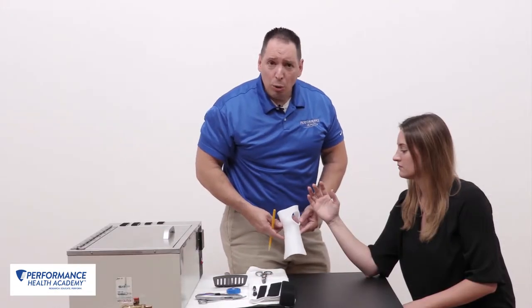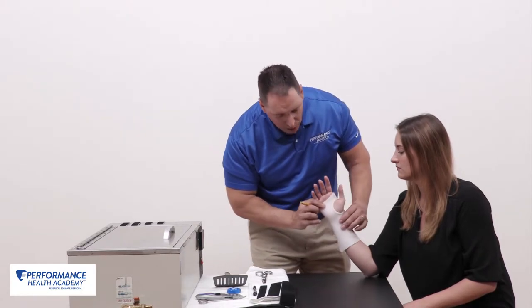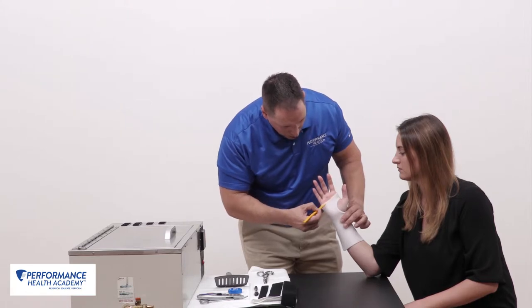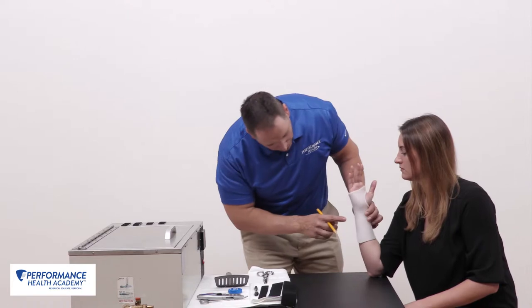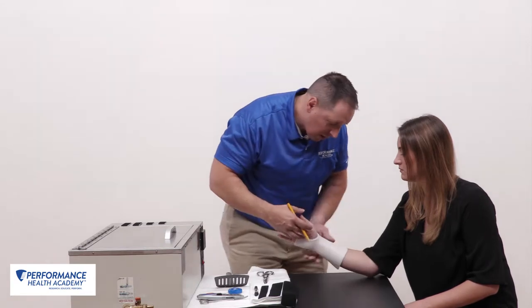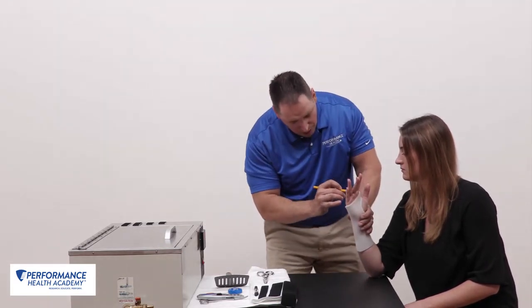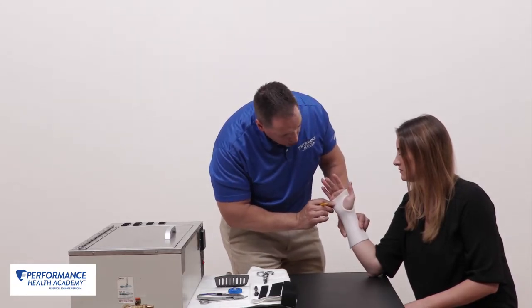Now that our pattern has cooled, we're going to reapply to the patient and trim down areas that may be troublesome. We want to make sure to go below the distal palmar crease to allow the MCPs to flex appropriately. We'll make sure the pan is about half the width of the forearm if it's too high, and trim any excess material that may cause issues.